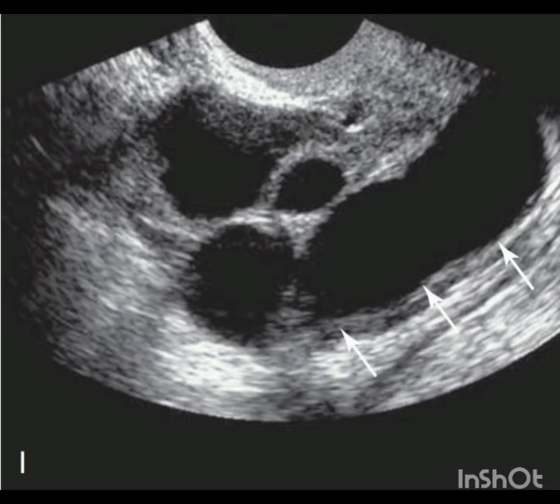When the scan plane of the previous image was adjusted, now you can see the typical appearance of the hydrosalpinx, which is more tubular. So this sums up my video.